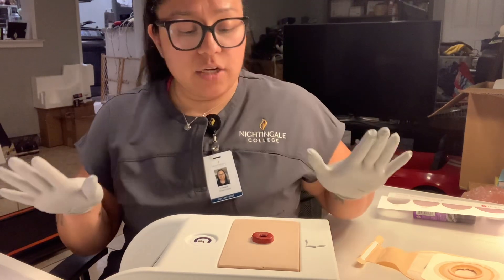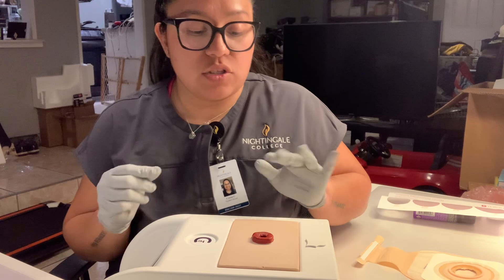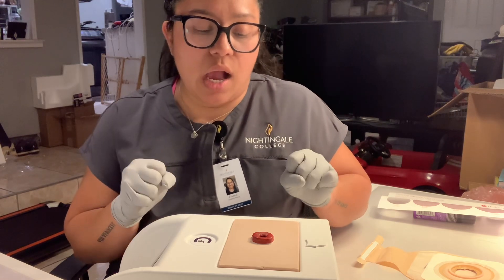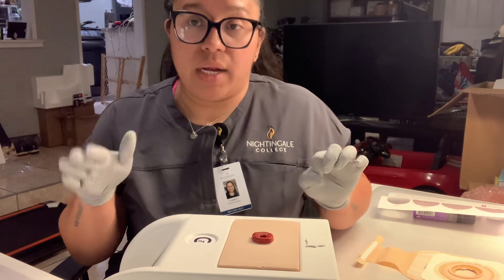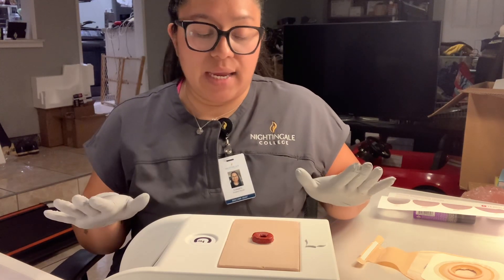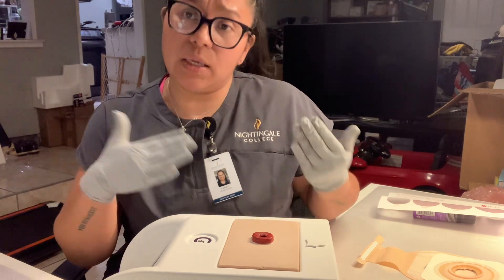Now that it's patted dry, this is the time to assess the area. We want to make sure that there's no irritation, no redness, and no discoloration around the stoma itself. The stoma itself needs to be within colors of beefy reddish. If there's any abnormality or discoloration other than beefy red, we need to let the provider know. As of now, Mr. Conde has really good skin — no irritation, no redness, and his stoma is beefy red, how we would like it to be.